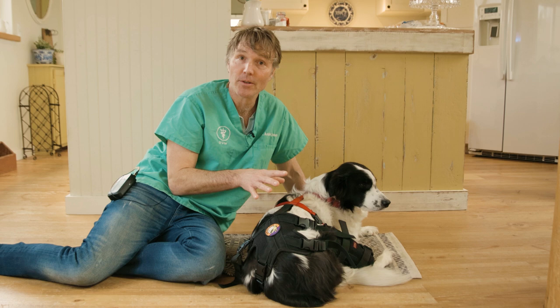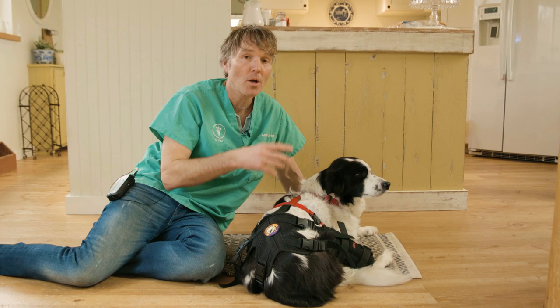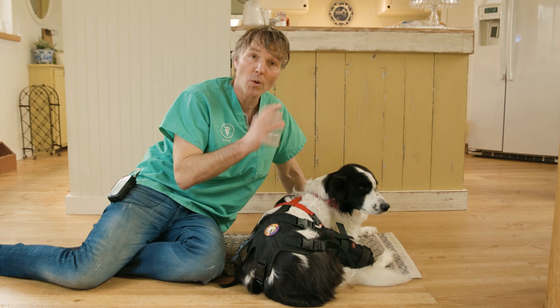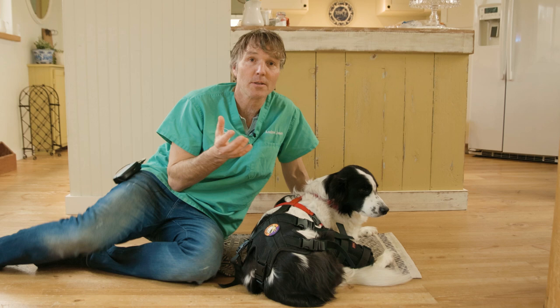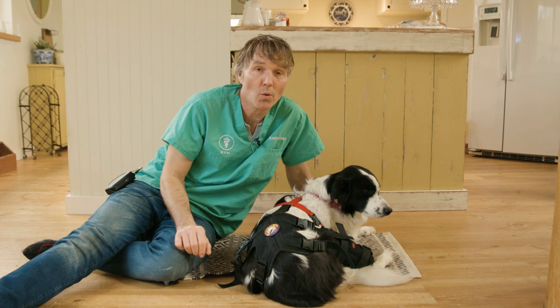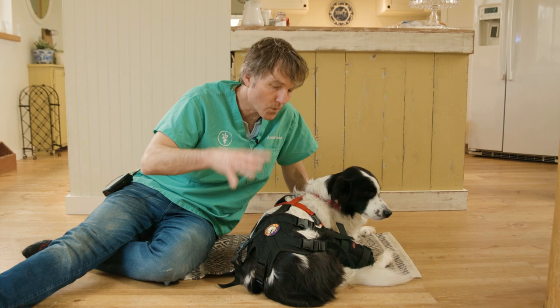Post-op care is super important. In human medicine, people who get detailed physio exercises and stick to them often have higher long-term success rates with a stable knee than those who only had surgery. These braces — especially this Ortho Dog brace — can be really critical in giving your dog a long-term result, whether or not they even have surgery.